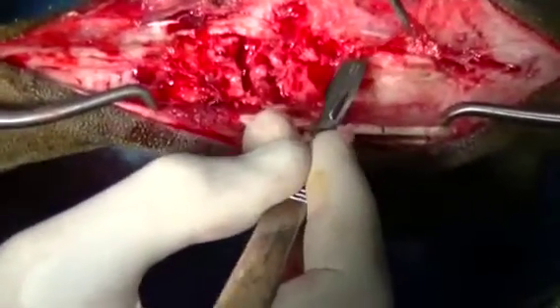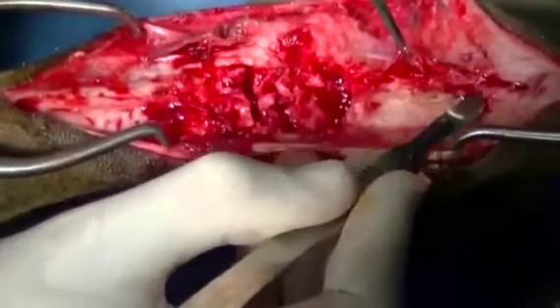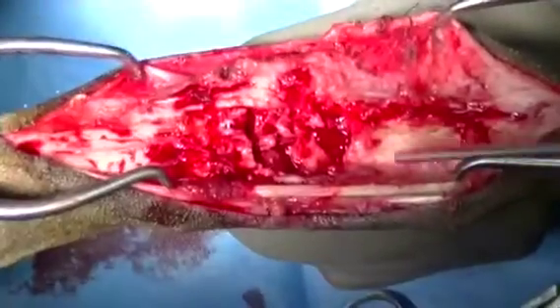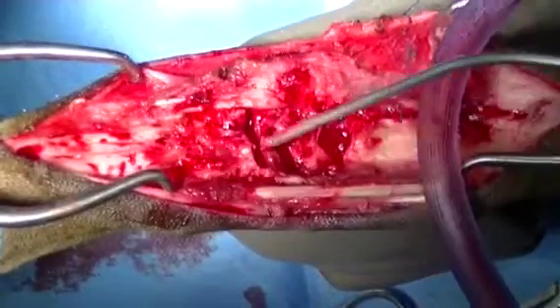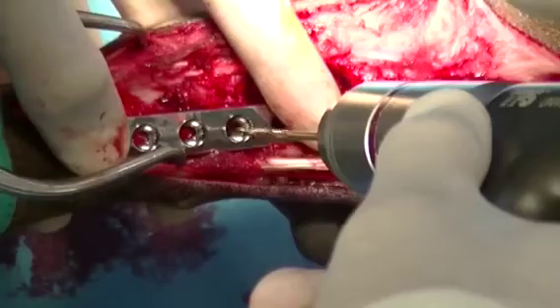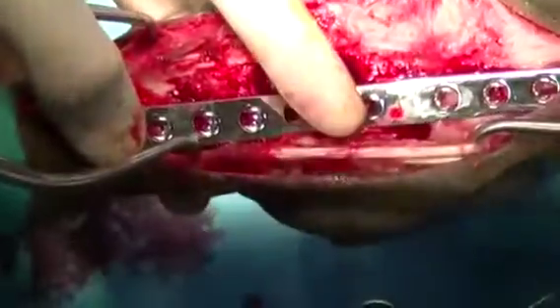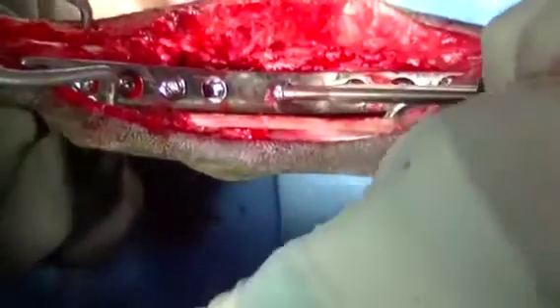At this point, we're just exposing the bone of the tibia such that the plate can be affixed to the bone without any soft tissue interposed. A specialized hybrid arthrodesis plate is affixed to the dorsal aspect of the bone, and that plate was pre-contoured to 135 degrees, which is the resting angle of the tibiotarsal joint in the dog.